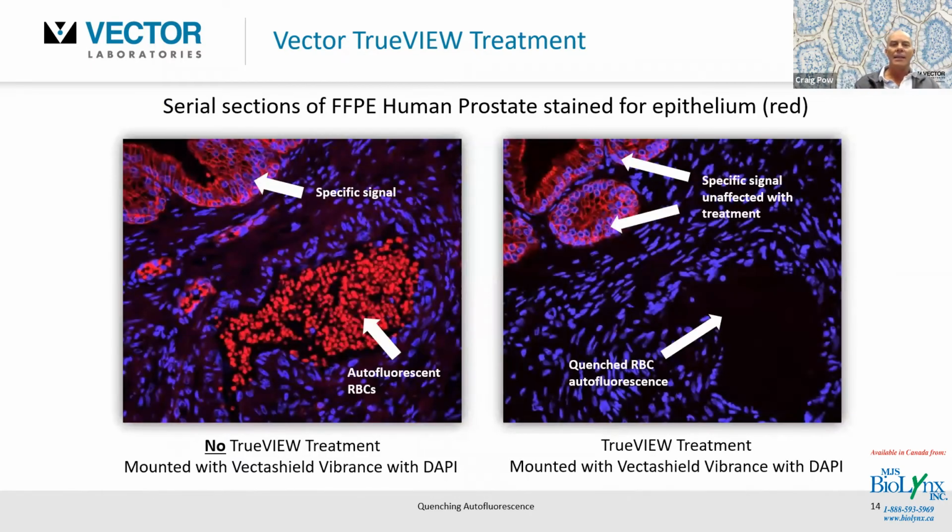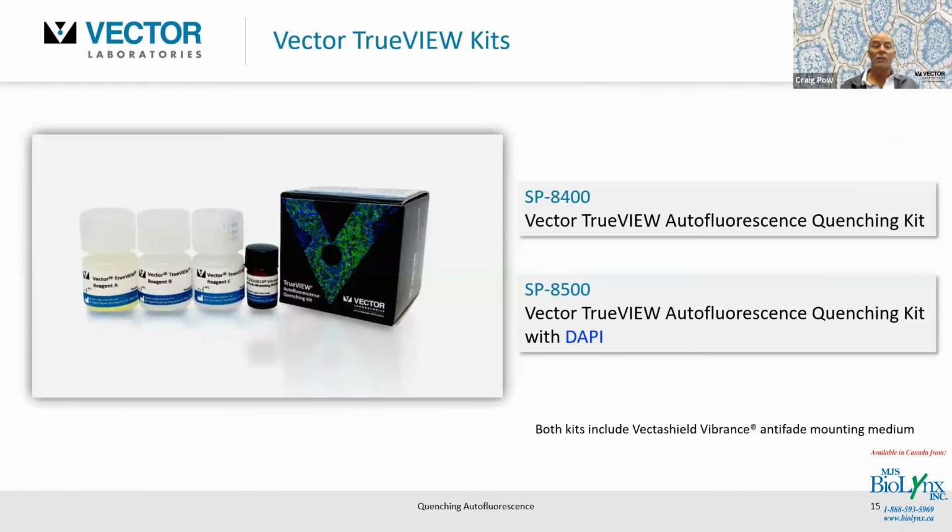Okay, and certainly in the red channel here, again, specific staining for a cytokeratin marker, and this is counterstained with a DAPI. These red blood cells could be interfering with what you're trying to interpret here. This is just an example. When you treat with TrueView, all of the red blood cells, autofluorescence has been eliminated. All right, hopefully that gives you a bit of a picture about the action of TrueView.